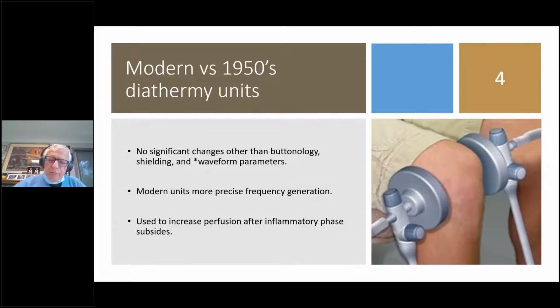So old versus newer forms of pulse electromagnetic fields, essentially they're the same thing, but the newer version has obviously more bells and whistles. It's more specific. The waveform and energetics in particular have been refined, and there is much better shielding. And I mention this latter point because, at least in our facility, oftentimes we have patients getting a Provant treatment, and they are adjacent to other patients who have implants, whether they are paced or spinal cord stimulators. So it's important that these devices are constructed well.